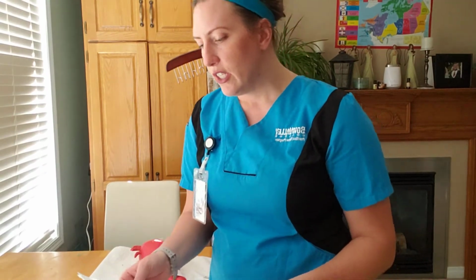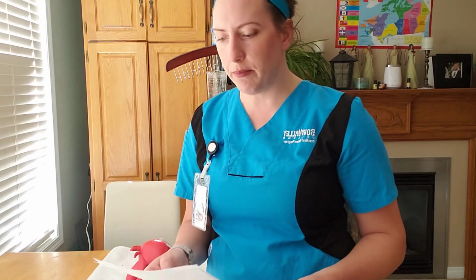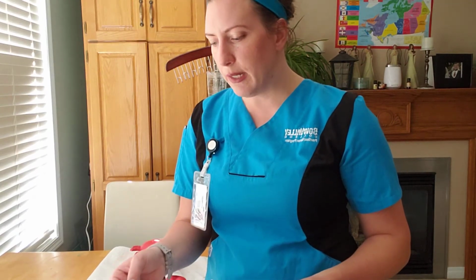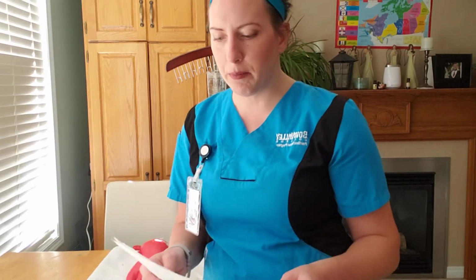Okay, so before I pull any medication, I'm going to have a look at how I'm going to be administering this. Again, the order calls for intravenous piggyback as well as the MAR. So I'm going to make sure that it is compatible on the monograph for that type of administration. Acceptable routes are direct IV and intermittent infusion. I see there intermittent infusion is IVPB.